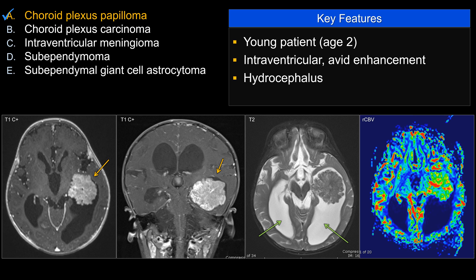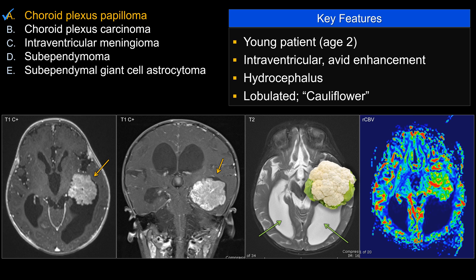The perfusion-weighted sequence doesn't really help you when it comes to differential diagnosis between papilloma versus carcinoma, although some textbooks would suggest carcinoma has higher perfusion. This is described as a lobulated or cauliflower-like appearance.